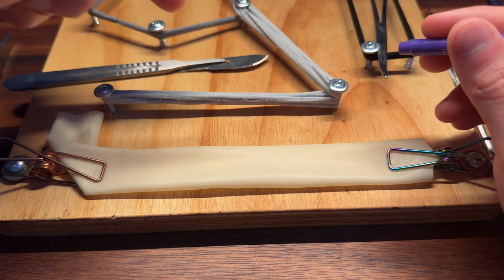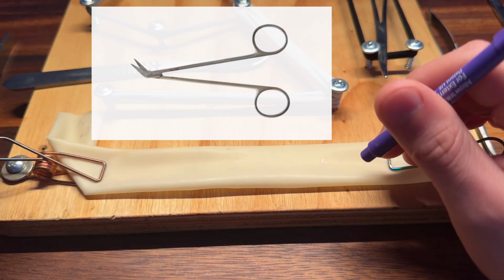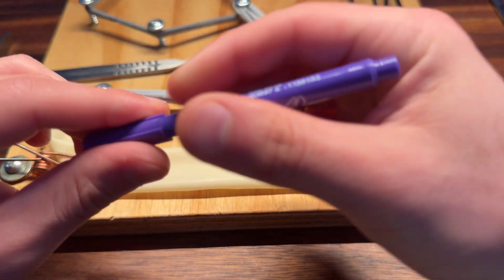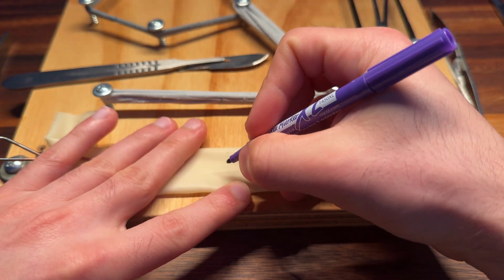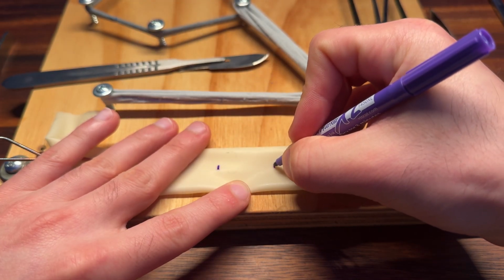So I'm going to use a scalpel here to cut into a blood vessel. In real life, use something like Pott's scissors, and these are just scissors that create very small openings. But essentially, let me go ahead and mark this to figure out what my angioplasty is going to be. So I'm going to start it here, and I'm going to end it somewhere around there.